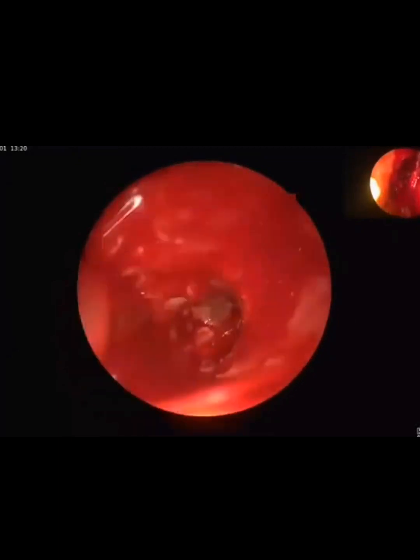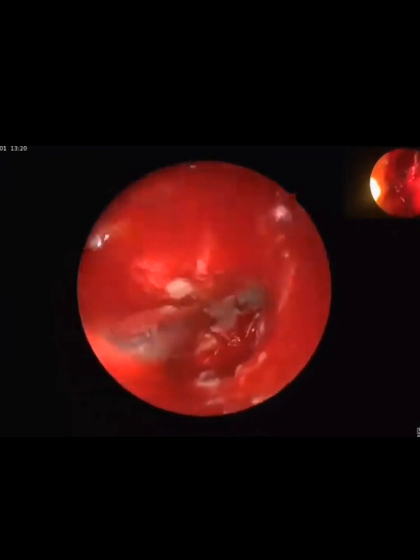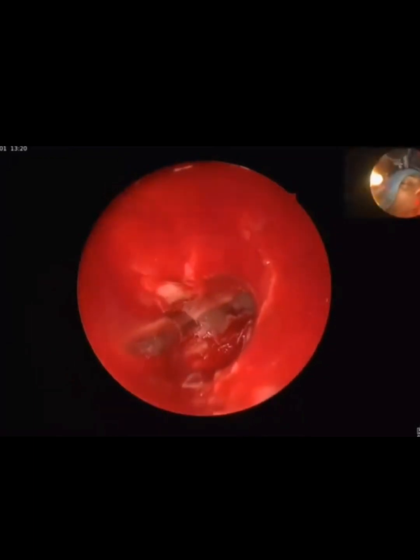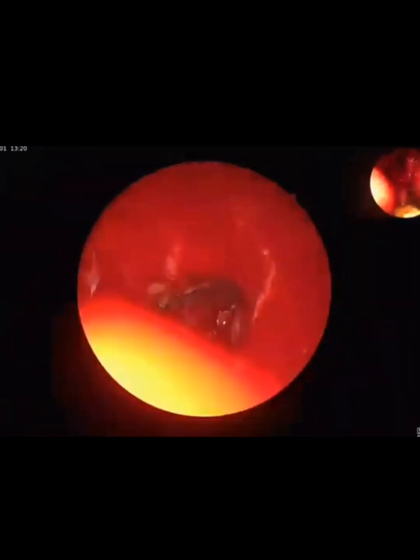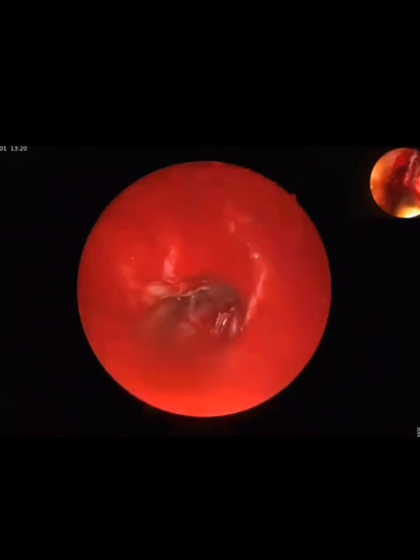After reaching the target area, in case of using a debrider, this is a very important point for juniors: open the suction of the debrider at the target area. Otherwise, it injures the surrounding mucosa. I am clearing the supraorbital recess.